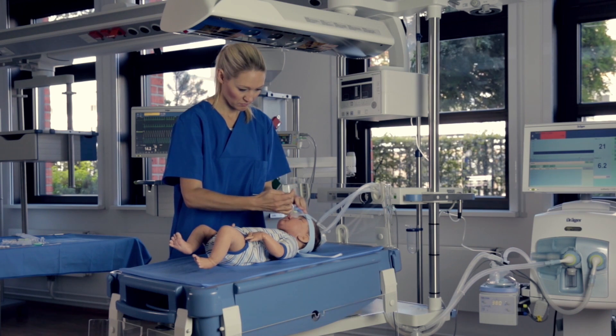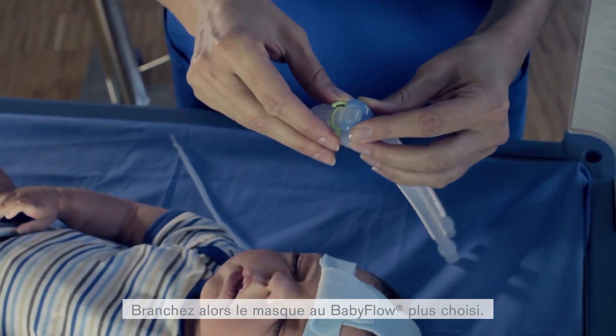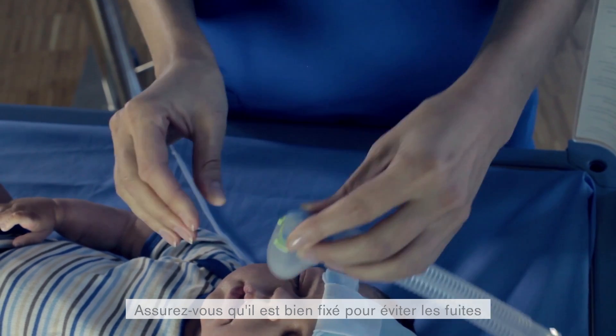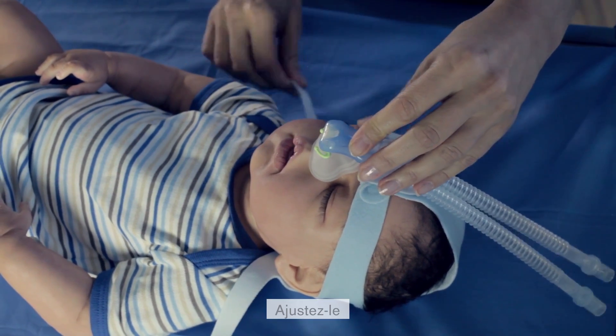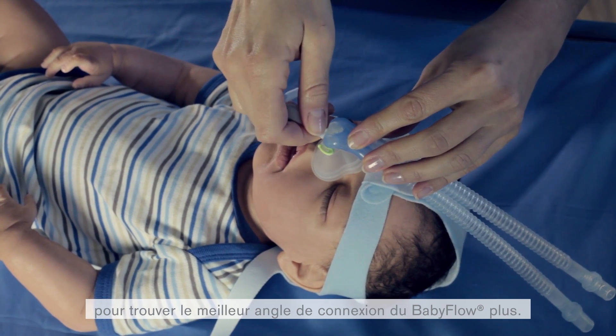Take the selected mask and thread the number 4 headgear strap through the clip. Now connect the mask with the selected Baby Flow Plus. Ensure that the mask is sitting securely enough to avoid leaks but not so tight that the fixation will result in pressure marks on the patient's nose. Take time to adjust to find the best angle of the Baby Flow Plus connection point.